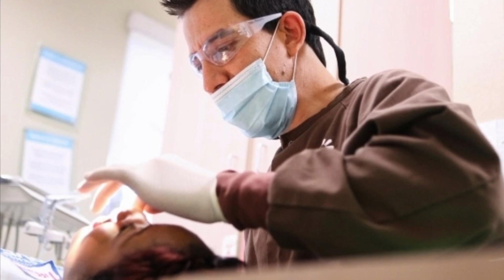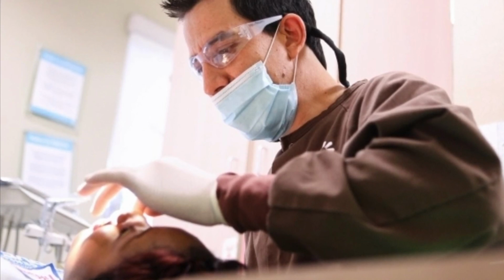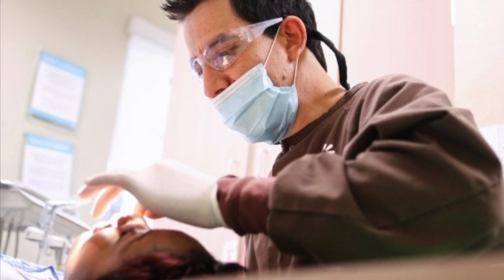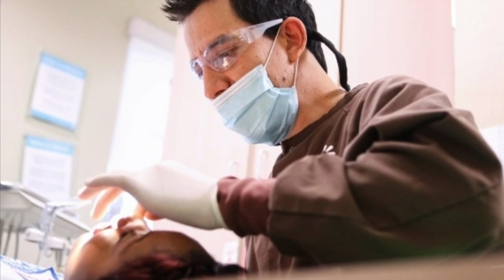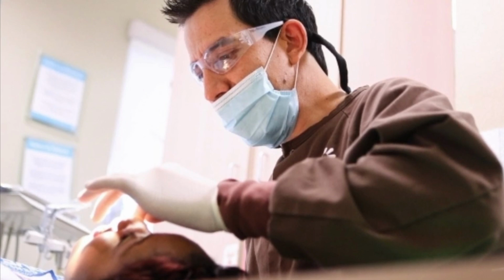Next, bending a Hedstrom file results in points of greater stress concentration than occurs with the K-file instruments. These concentration points can lead to the propagation of cracks and fatigue failure. Hedstrom files are formed by grinding a single continuous flute. This is why we use it only with pulling action, and it is very susceptible to breaking if we use it and bend it.